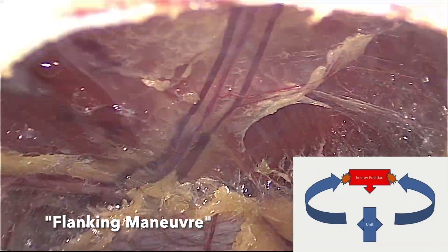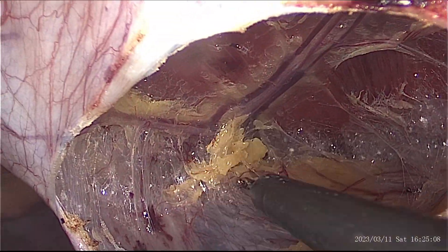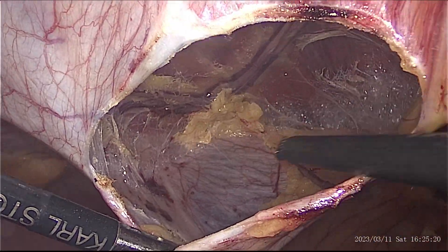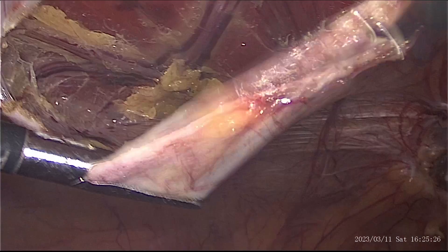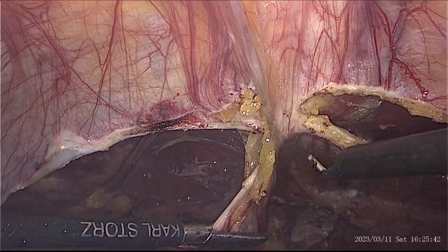This is almost like a flanking maneuver used in military tactics to neutralize the enemy, although in this case we are doing it to preserve the linea alba from any injury during the flap dissection. Flap dissection in the midline is done after creating both retromuscular spaces.